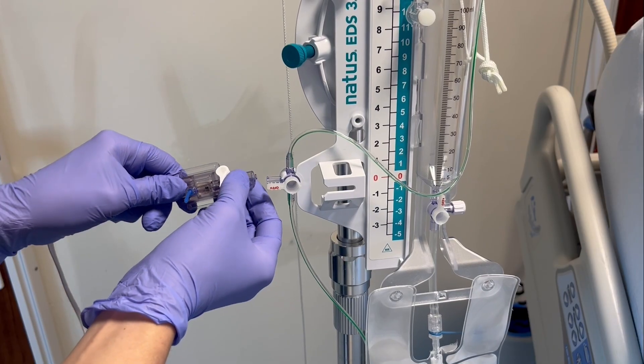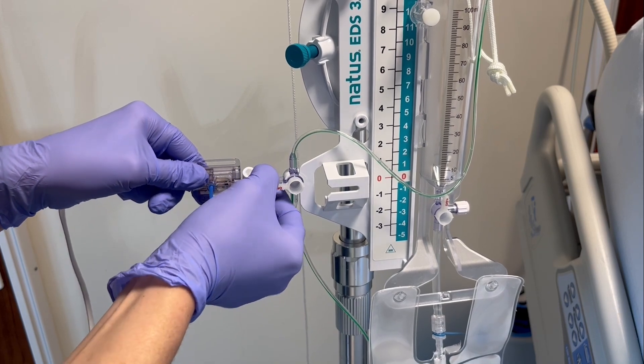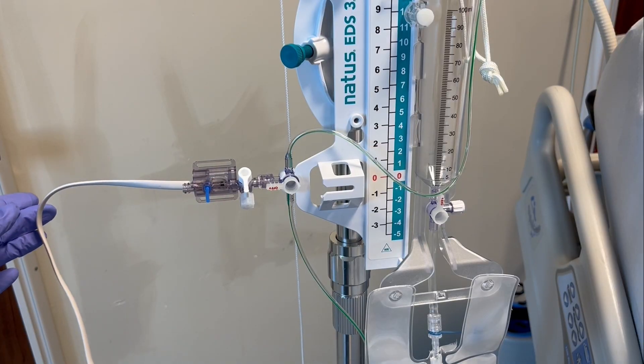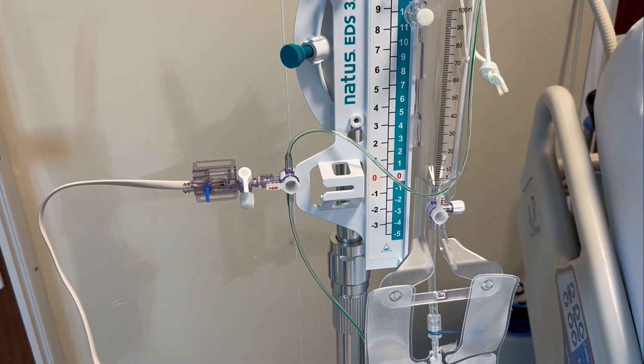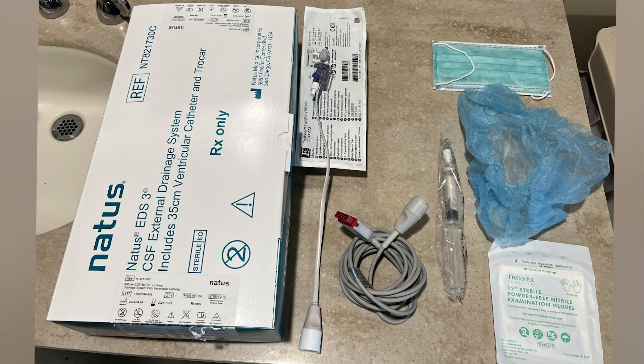Now that we know what an EVD is, let's talk about some of the things you might encounter as a nurse when taking care of a patient with an EVD drain. You may need to help set up the drainage system, which includes attaching the transducer to the drain and priming the drain. For insertion, these are the supplies you will need to gather: an EVD drainage device — in this video we will be using Anatis. We also need a transducer; for this we're going to use an arterial line transducer.